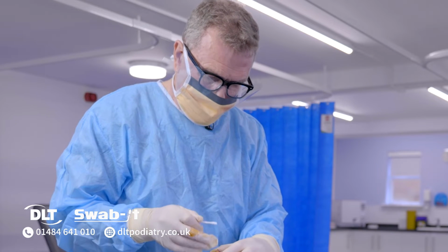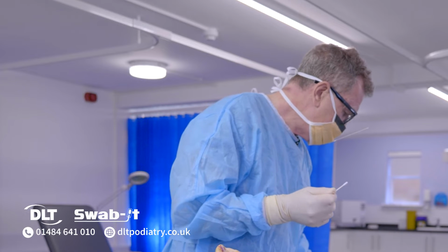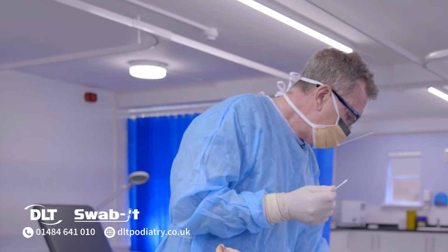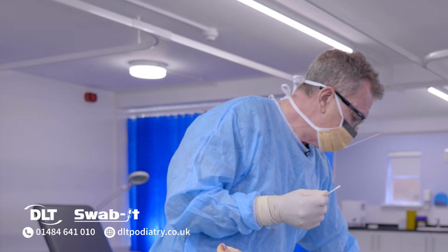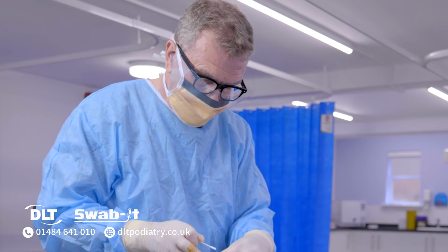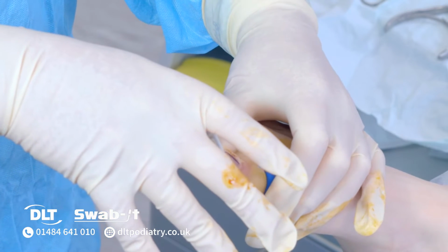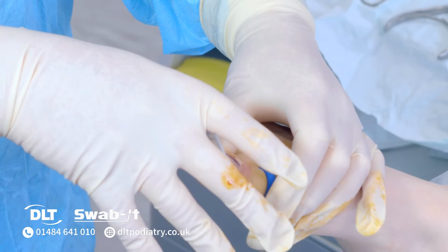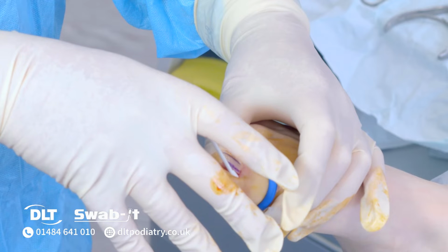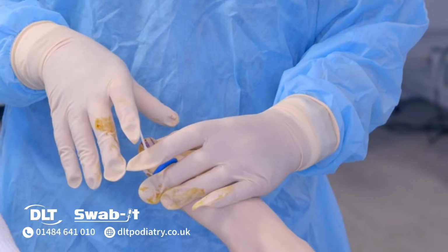There has been some talk about bud size from Swab-It. These are Swab-Its. I've used Swab-Its for 15 years and find them a very, very good product. There are some smaller bud sizes in the pack if you need them. I never use them. I always feel that this, as you can see, fits nicely into the wedge. And some podiatrists who question the bud size, it begs the question whether they actually are removing enough of the nail for a wedge resection.